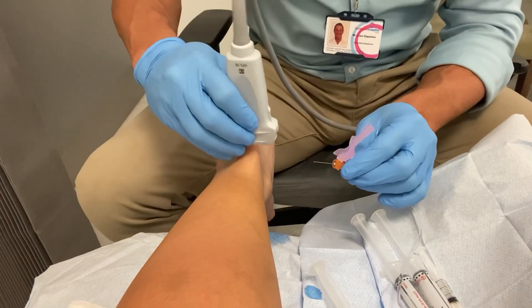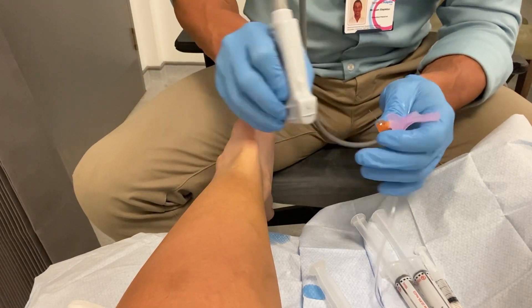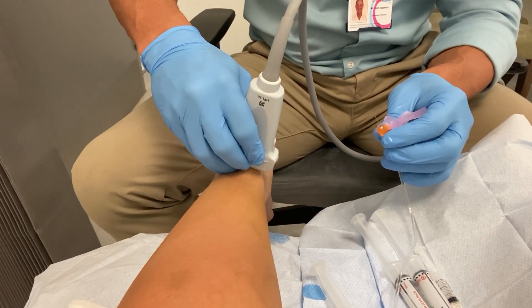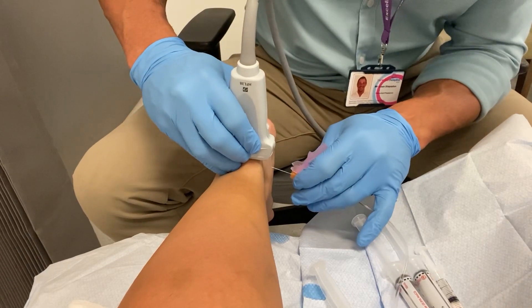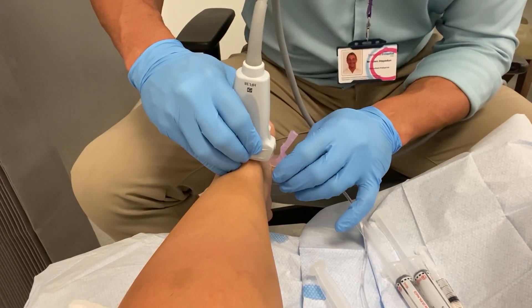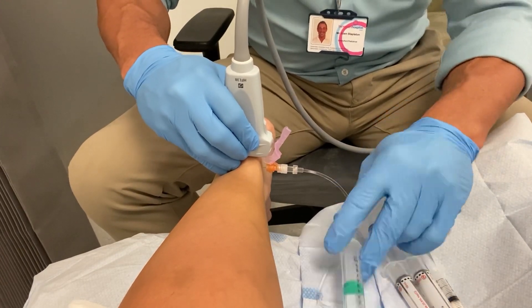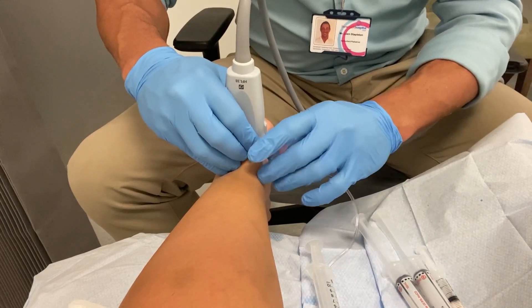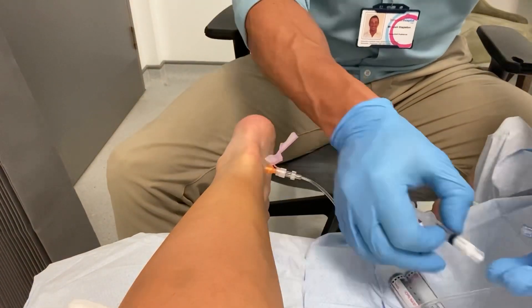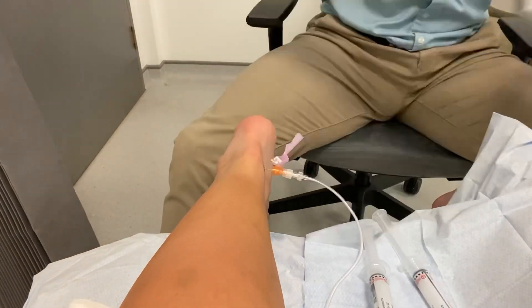Welcome to this video of me performing a high-volume hydro dissection injection for a mid-portion Achilles tendinopathy. This lady had been suffering with her Achilles tendinopathy for over 10 years and this was beginning to stop her recreational sporting activities. We use the ultrasound scan to visualise the worst part of the Achilles tendon radiologically — what I'm looking for is the most neovascularisation, or in lay terms for anyone non-medical, the most inflamed bit of the Achilles tendon.